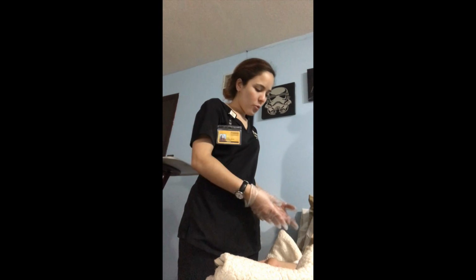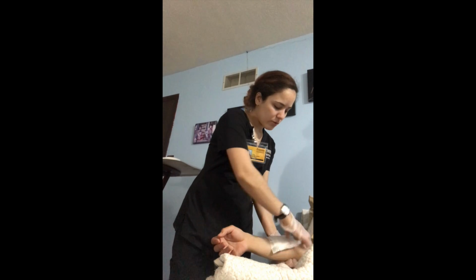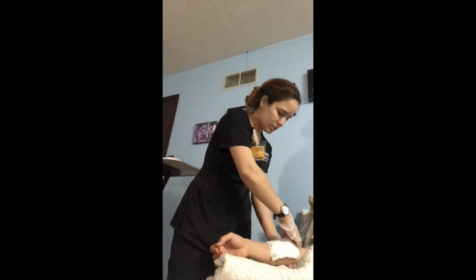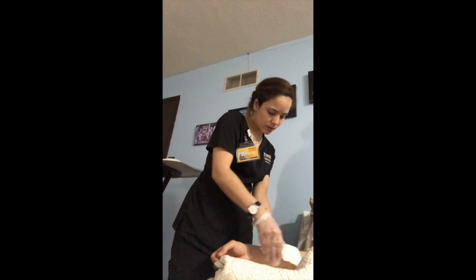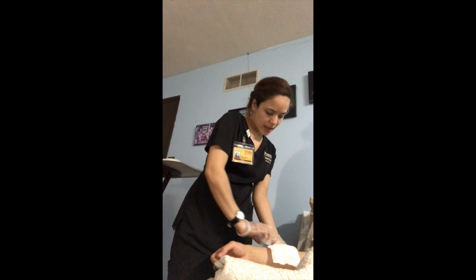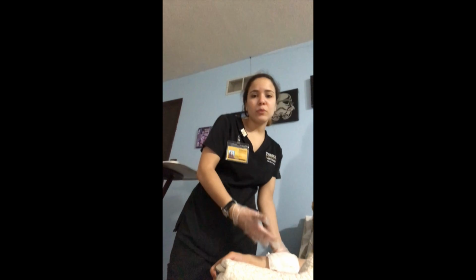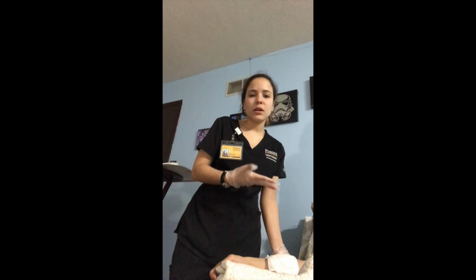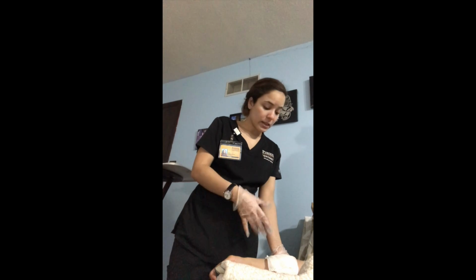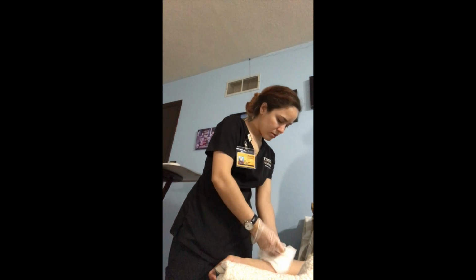So now we can start removing the dressing. We need to loosen the edges of the tape and remove it carefully. If it's hard to remove, we can soak it with normal saline so it can be easier to remove. So I'm going to remove it here.